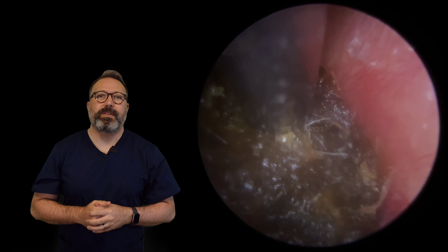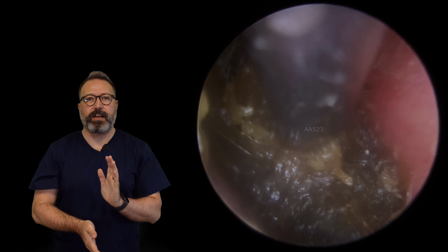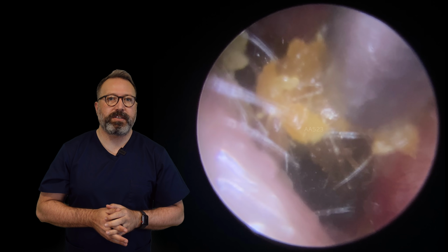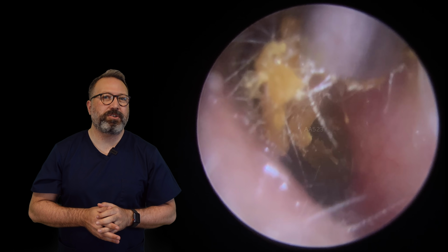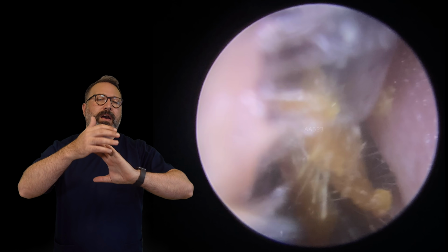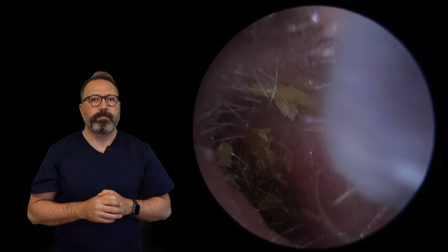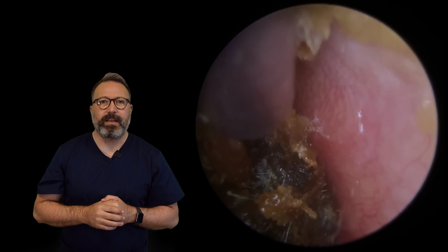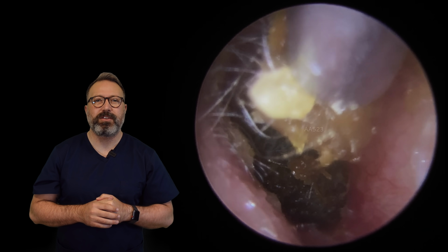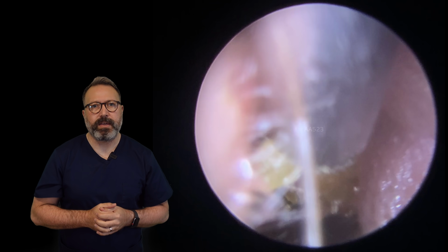Now, this is always hard. When you get these dry, flat-fronted sections of wax, always tough ones to take away. But this one, luckily, is starting, well, I think that's just the top section there that's come away, yeah. But it may well have just dropped the top part of the wax. It might just have pulled that forward as that came away then. Yeah, you can loosen that bit there. Let's get rid of that, and we'll have a better view behind that then. So you can see lots of tiny little crumbly pieces coming away here.